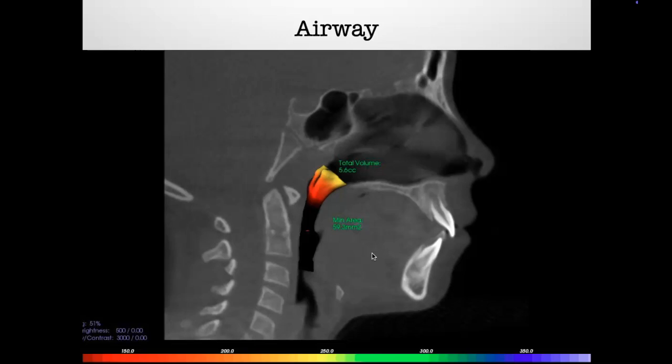So we would typically consider normal or average about 80. Now, this is not diagnostic in any way. We already took the sleep disorder breathing questionnaire. There weren't a lot of signs or symptoms of sleep disorder breathing. So even though this is, according to our radiographic norms, a little bit smaller than normal, that doesn't mean that there's a problem, right? It's just something, again, we want to make sure we're asking those questions.